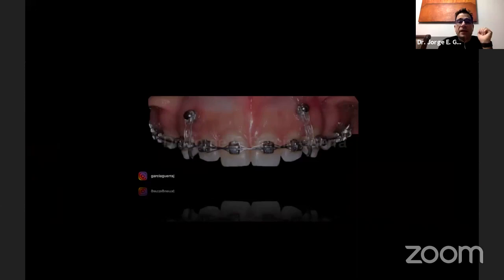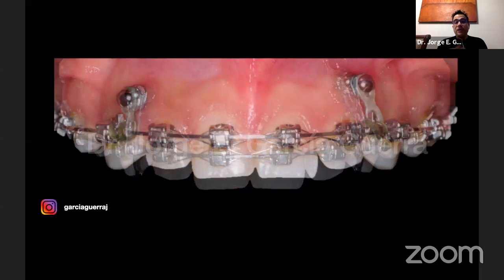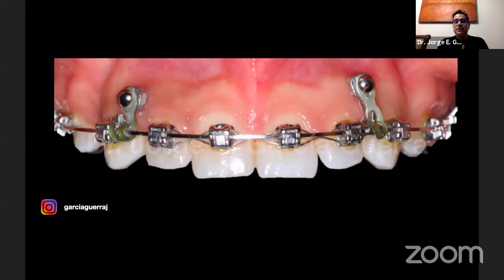Okay, now it's very common for us, in some cases like extraction cases, if we don't control the anterior position of our incisors, in the moment that we start retracting, we're going to get an excessive overbite. If we don't do a controlled space closure, we're going to have this negative effect. Now, these mini implants help us a lot with intrusion, to correct the overbite when we're doing a space closure. But they also help us in cases where we have a gummy smile. We can intrude the anterior incisors a little bit, and it's going to be a more aesthetic result at the end of the treatment, okay?